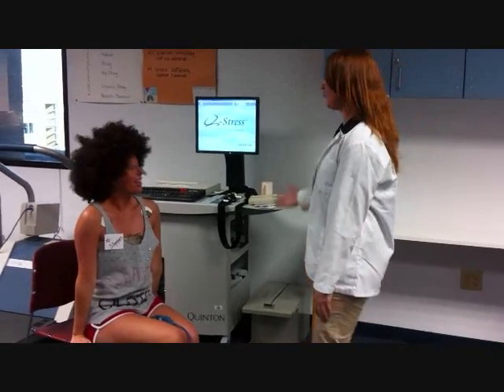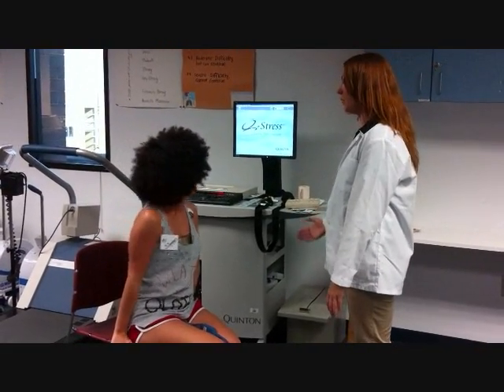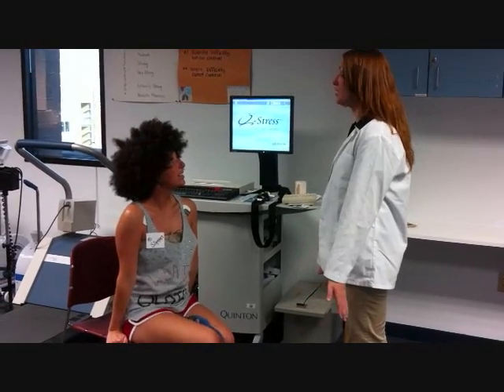Perfect. So now that we have a measurement of your resting EKG, we need to have a measurement of your EKG during exercise.